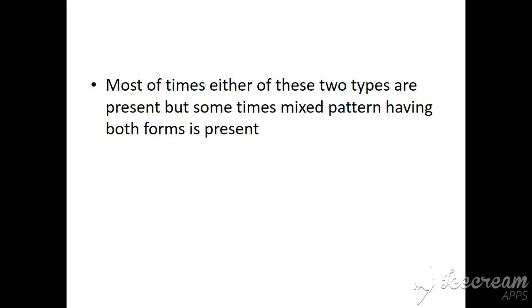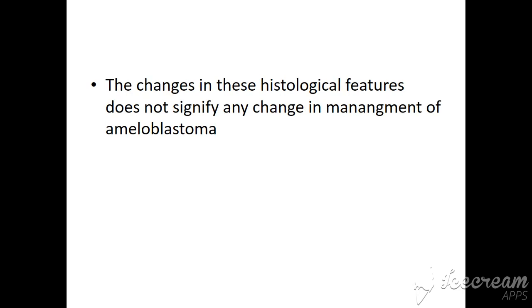Most of the time, either the plexiform form or the follicular form of ameloblastoma is present, but sometimes there are mixed patterns showing both forms. There will be the follicular form and the plexiform form, and both patterns mix in this form.